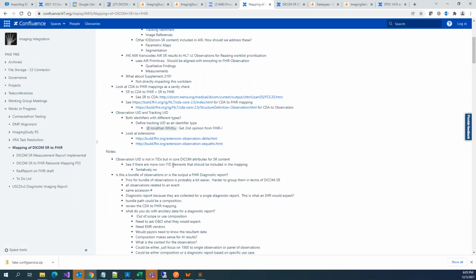Understood. I was also thinking that we can encounter some sort of private codes in the DICOM SR. Yes, that is where the intention of interoperability using the AIR profile comes in: we should not use any DICOM private tags. Rather, we should go with this AIR profile.